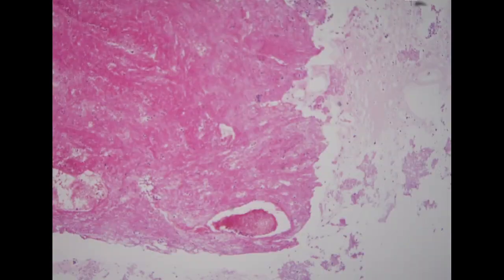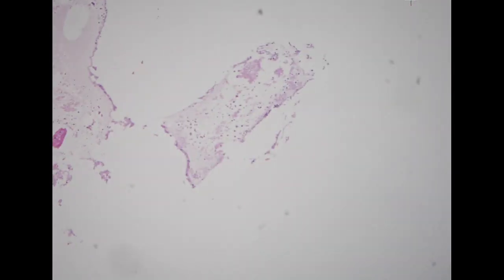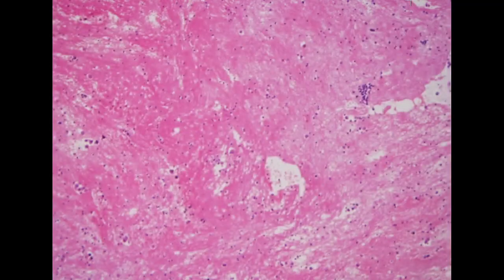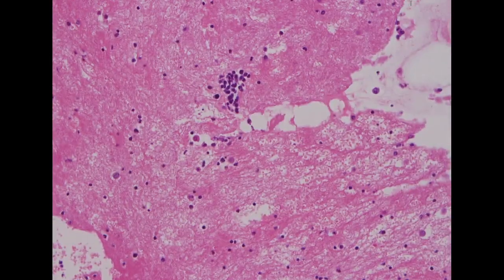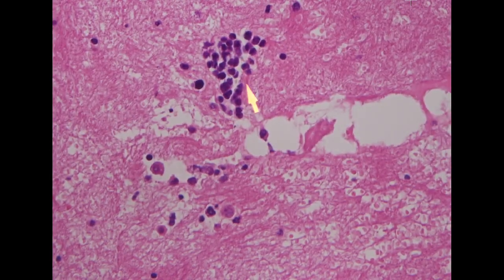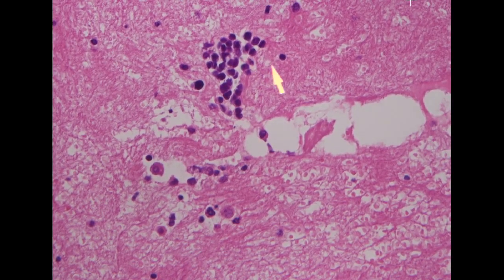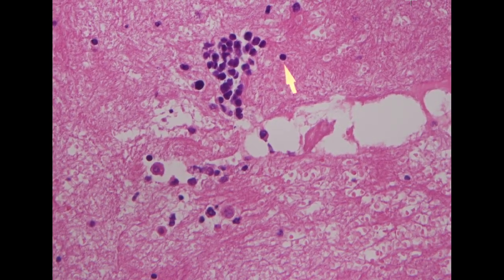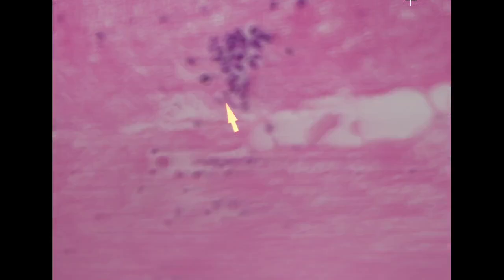However, if it is a new patient, you really need to pay attention to these details of the cytomorphology. So again, it looks not obvious, but you see the molding pattern, and you compare the size and the chromatin pattern of the adjacent normal inflammatory cells. This is small cell carcinoma.